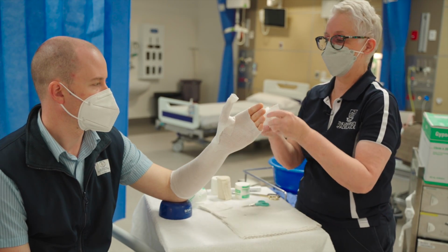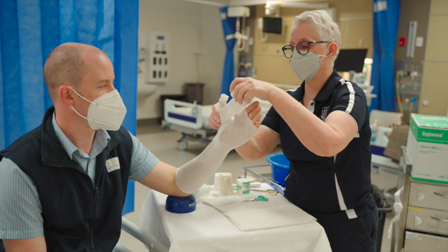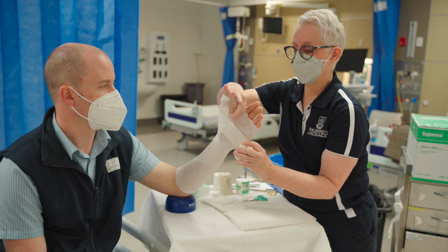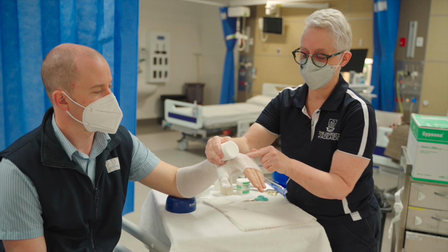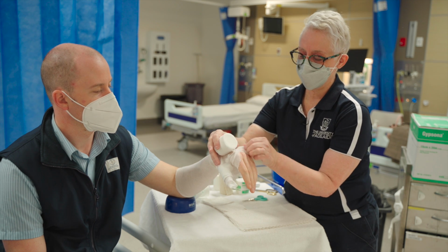So we take our padding and we start around the thumb and we circumference the thumb like so. If you get any pieces sticking up there, don't worry about that, you will collect it. Also make sure that you are clear of the metacarpal heads here so that once the fingers are bent up and down, they're not being hindered.